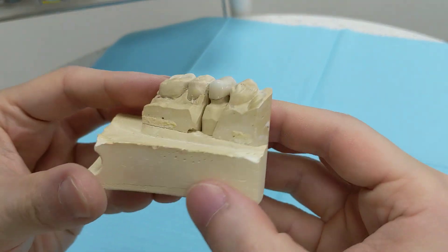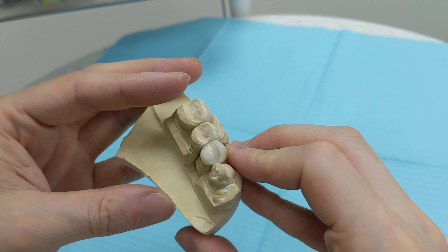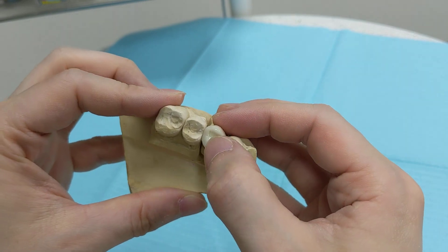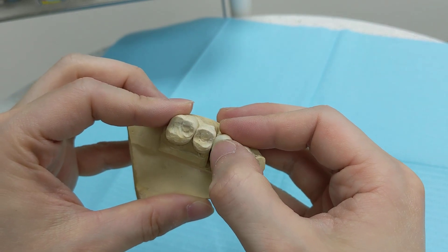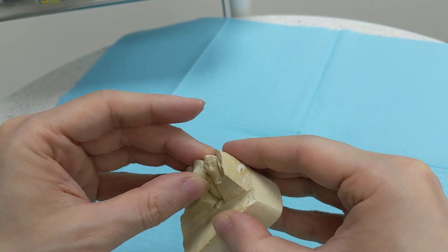As you can see, it's been made flat now — you can see the marks there. It's a very quick process to do.